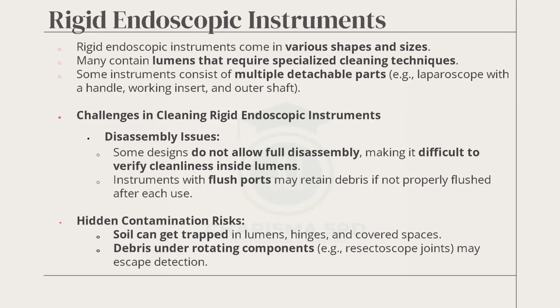The challenge is that the design is such that you cannot dismantle it, so you have to use the appropriate brush, or you have to flush it with a syringe. Whatever the IFU tells you to do, maybe it will tell you to flush it 3 or 4 times, you do the same. But because of shortage of instruments, there's a likelihood that if they say flush it 3 times, somebody will flush it 2 and get out of here. I just want to get out. So always follow the IFU.